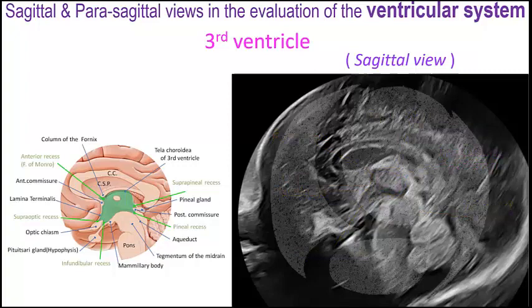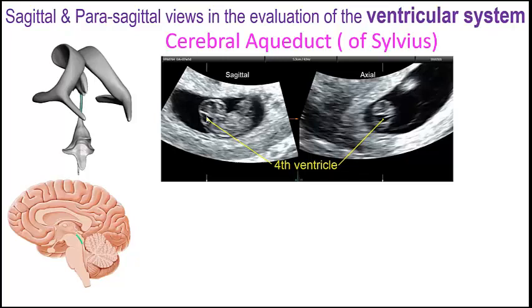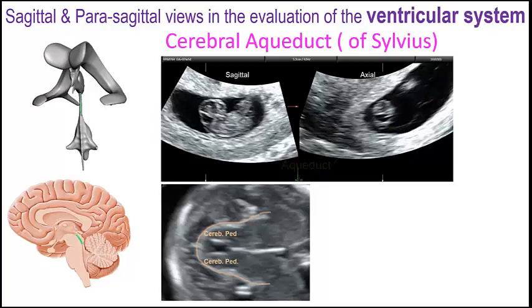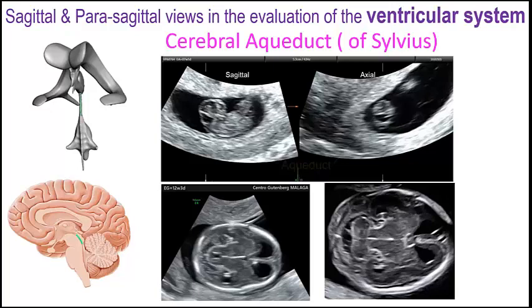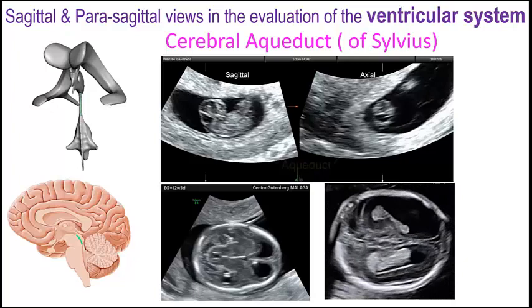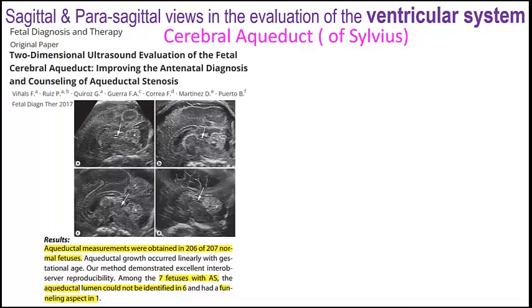The cerebral aqueduct or aqueduct of Sylvius is very prominent in the first trimester and also clearly seen in the axial views during the early second trimester. But beyond 18 or 19 weeks, its visualization in the axial planes is rare. So in the second and third trimesters, if we want to visualize the aqueduct, we must go to the mid-sagittal plane.